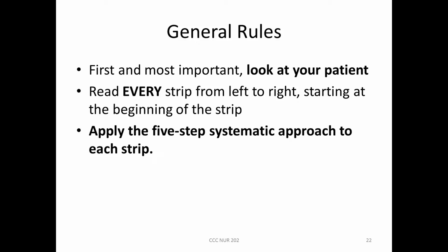So the general rule is to first and foremost look at your patient. You never treat the strip, the rhythm strip. You only treat your patient. A rhythm strip is like having lab values. You're evaluating it as just a tool to help evaluate your patient.